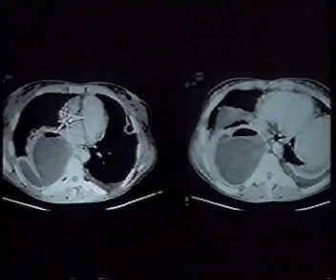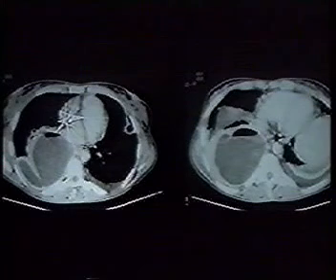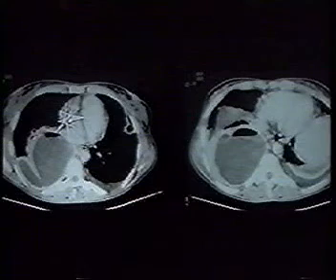So once we have seen this, we simply turn the patient on his or her side and using a trocar technique, place a catheter into this fluid collection and then attach the patient to a Pleurovac device for drainage.